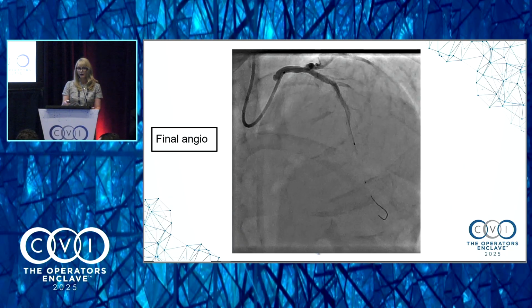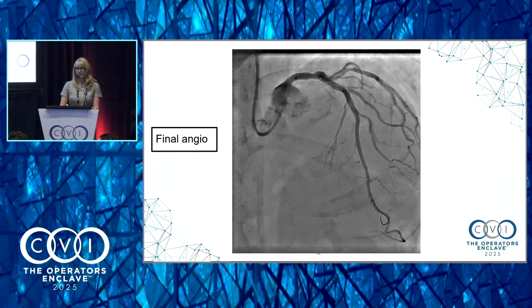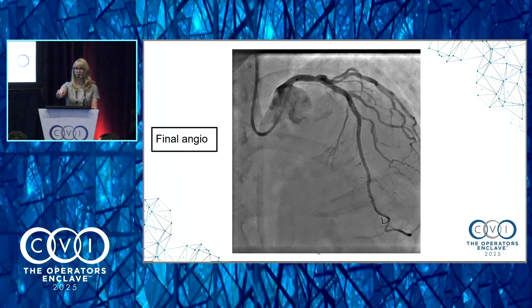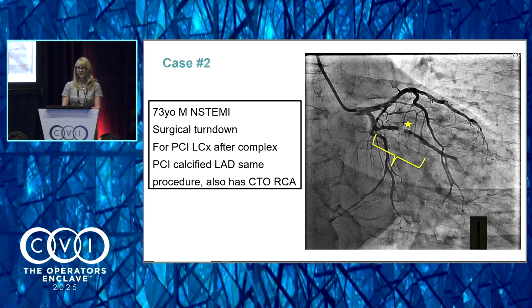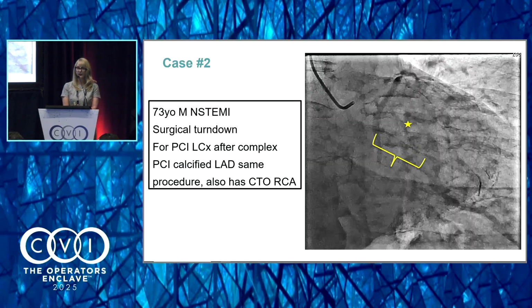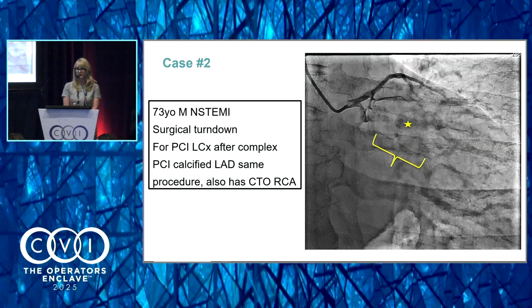Okay. So, and this was the final angiographic result that you see there. That's with the OCT catheter still down there, so there's a little bit of blood swirl there. And that patient has done well clinically. She hasn't had her follow-up yet. It was a pretty recent case, but no new admissions or visits to hospital.